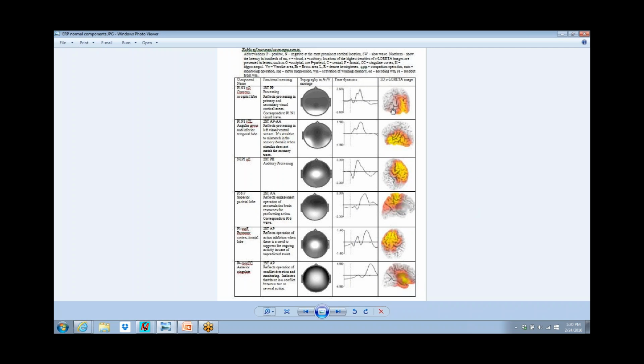There are times when brain damage in an area ends up standing out very, very well in the ERP. Now, EEG in traumatic brain injury is sensitive to change, but it's not specific. And as such, it's not considered diagnostic typically. And although there are people within the neurofeedback field and QEEG field that will argue vociferously about it, the EEG is in the American Academy of Neurology and International Federation of Clinical Neurophysiology. They say it's very sensitive to the changes, but it's not diagnostically specific.